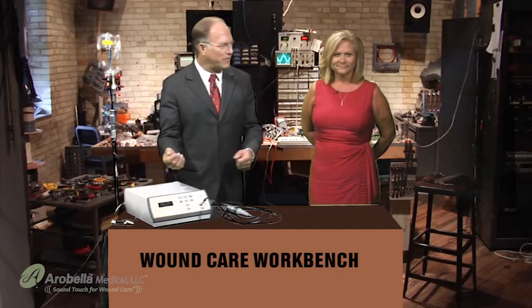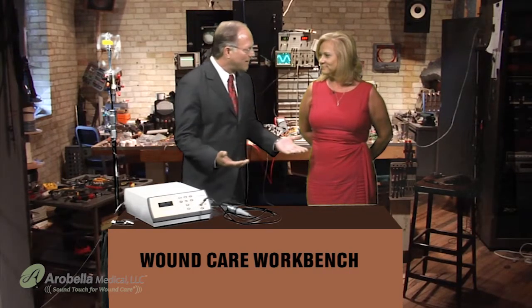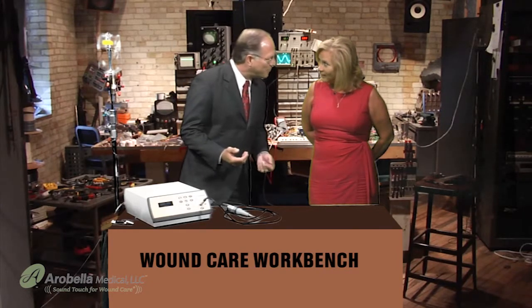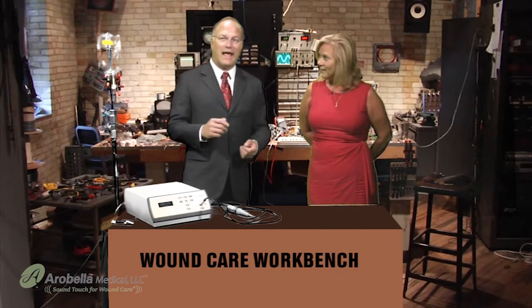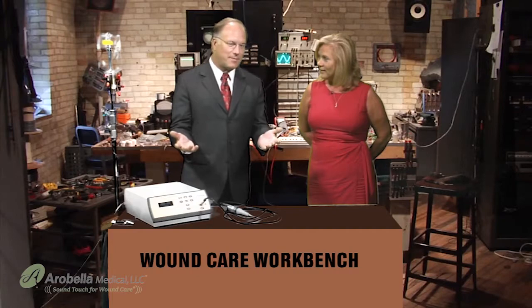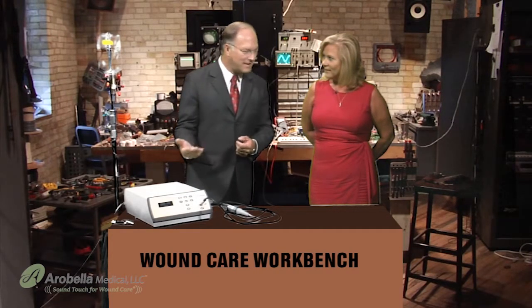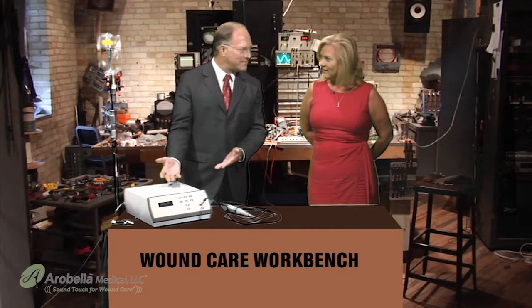Welcome to the Workbench segment. Chris, you just spotted a necrotic wound. What are we going to do about that? I think we need to clean it up. You need to debride necrotic wounds, you're absolutely right. In the technology segment on Workbench, we're going to be talking about the excellent debridement device, the Quustic Wound Therapy System.